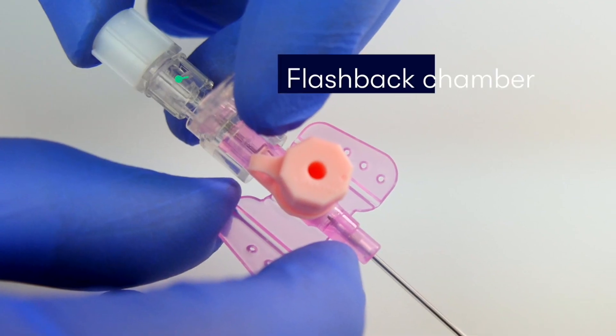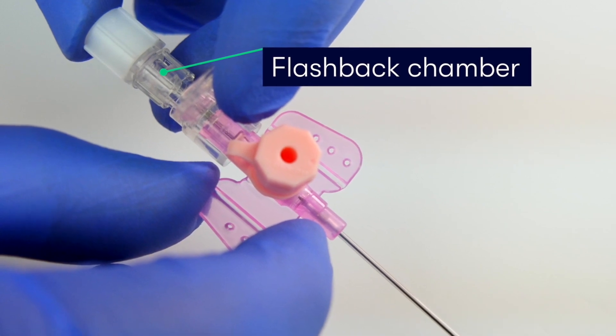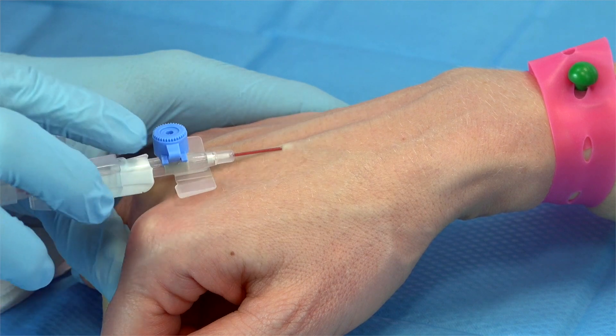Another component of the cannula is the flashback chamber, in which blood appears to indicate that we've successfully punctured the vein and therefore are safe to progress the catheter.